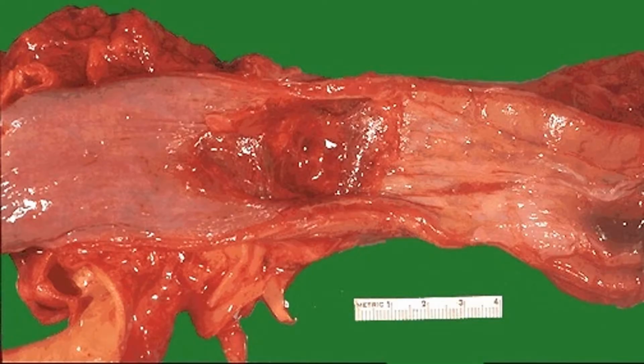Next is esophagus squamous cell carcinoma. The location is at the middle part of the esophagus, right? And you can see it is again an ulcerating tumor with an elevated and rolling edge, with a dirty and necrotic base with areas of hemorrhage and necrosis in the base.